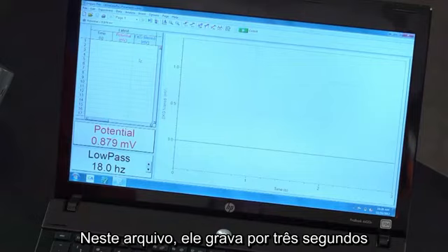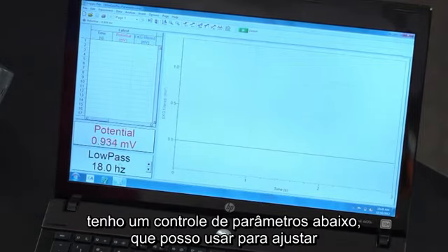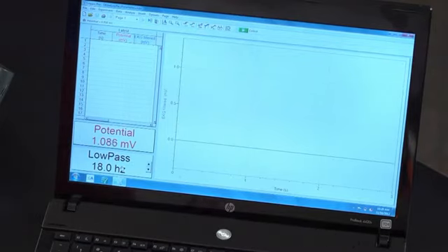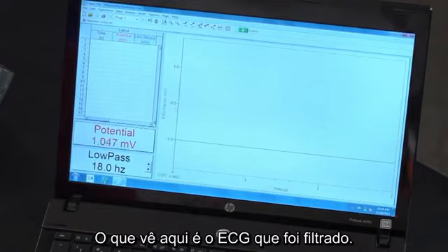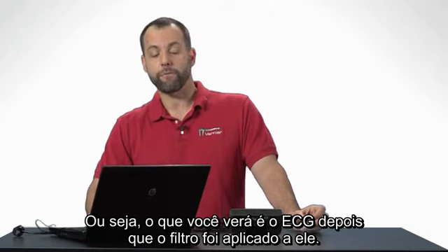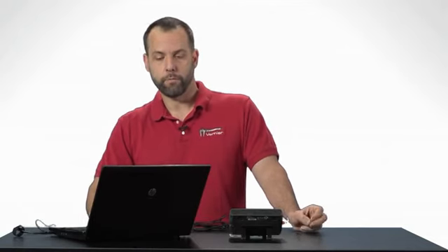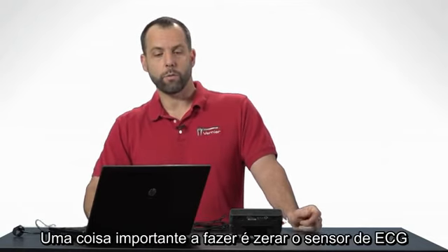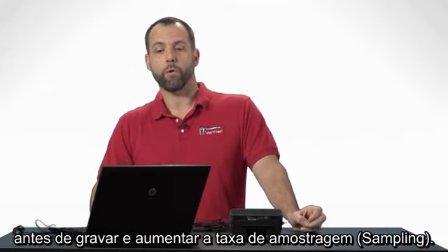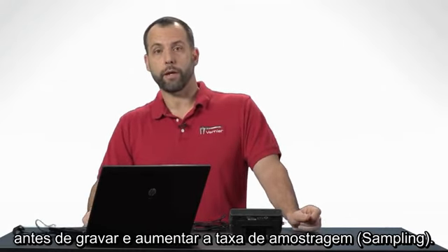Now in this file, it's going to record for 3 seconds. I have a little what we call parameter control down below, which I can use to set the low-pass filter. And then this right here is the EKG that is filtered. So what you will see is the EKG trace after a filter has been applied to it. An important thing to do as well, though, is I'm going to zero the EKG sensor before I record, and I'm going to increase the sampling rate.